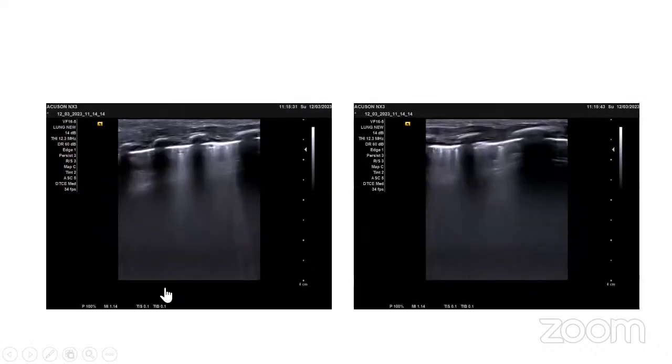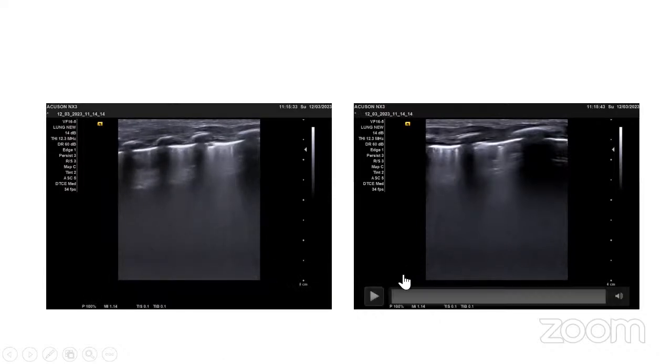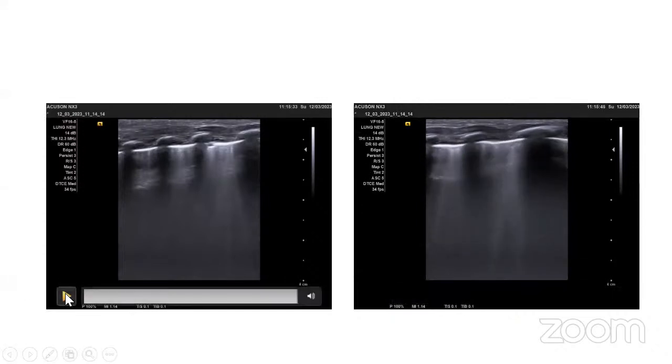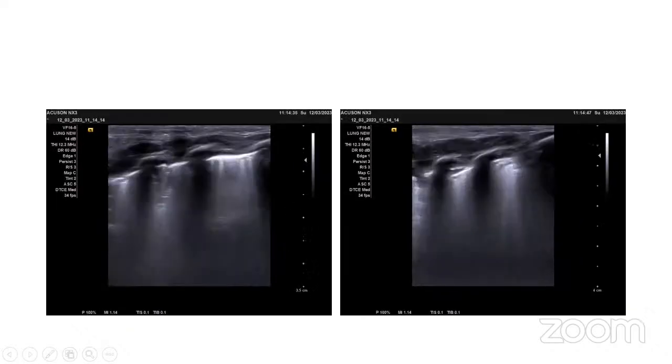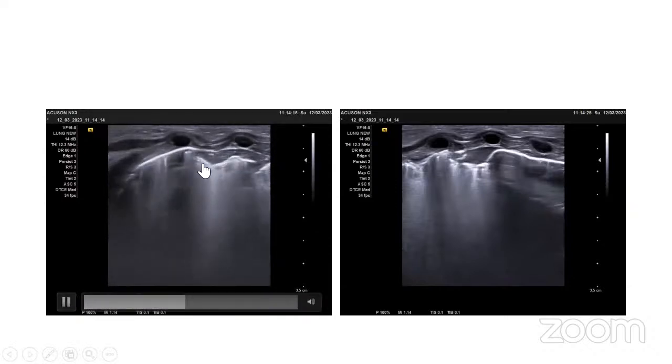And here's the last one, these two. Also the AB profile with some subpleural consolidation. And here AB profile. But I was so confused from the first image whether this is a shred sign or atelectasis. I couldn't find out at the beginning. This is my worry here. What was this? Is it a shred sign or this one, or what is this image with hypoechogenicity here?